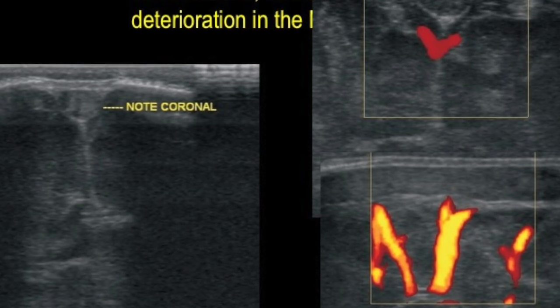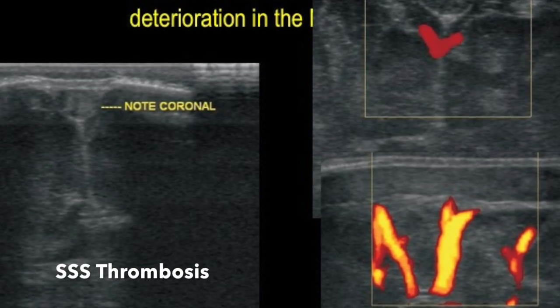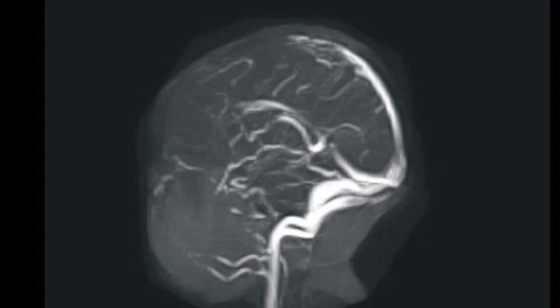This was a thrombosed superior sagittal sinus, which is very well seen on this time-of-flight MR image. The findings were confirmed.